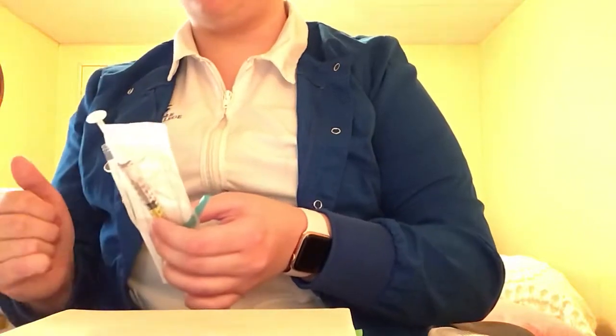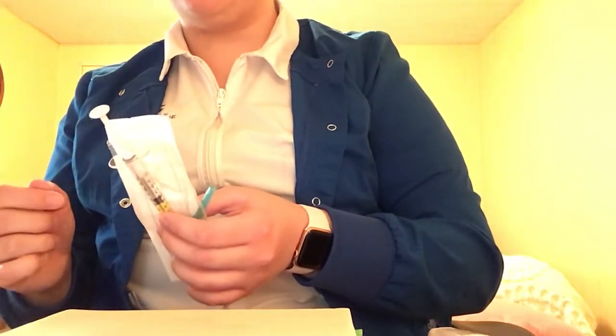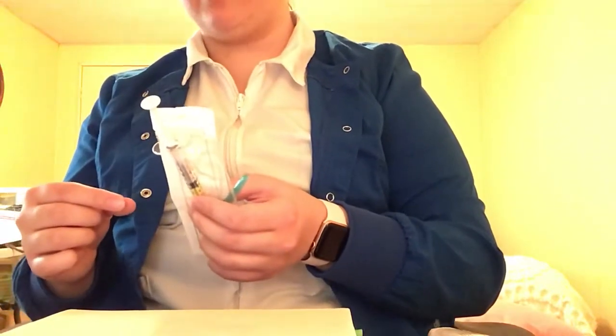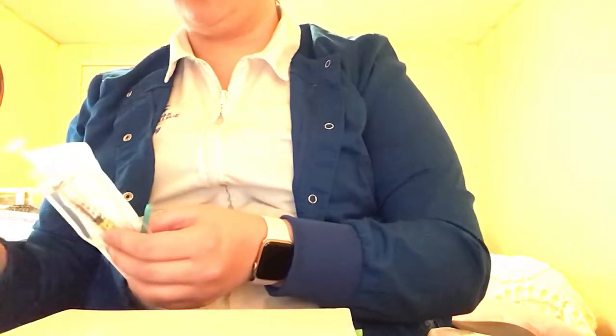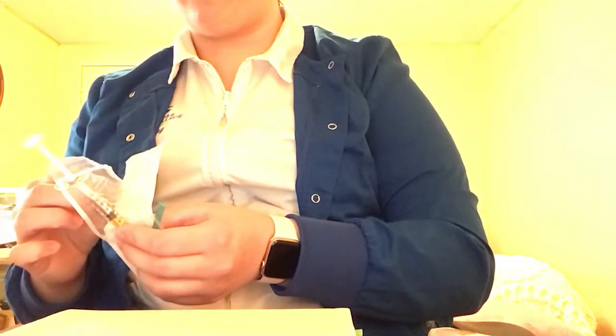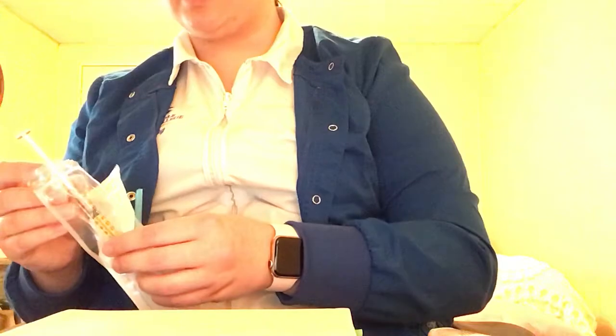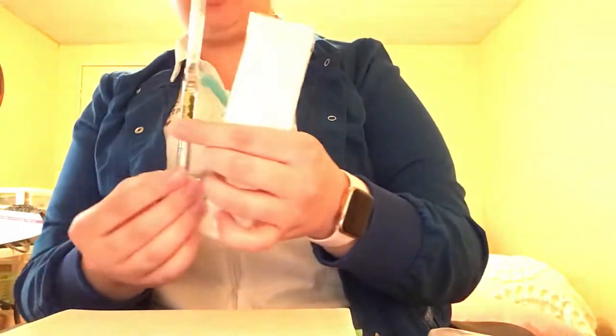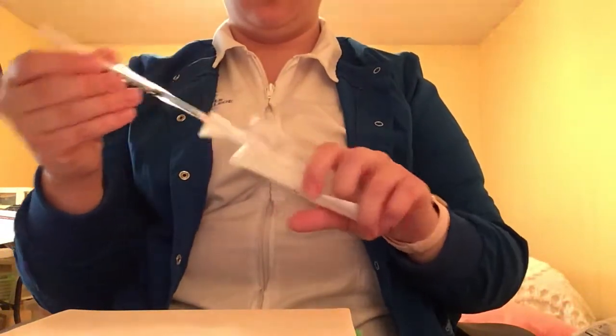So this is for Anna Powolowski, May 5th, 1957, penicillin allergy, and the reaction is hives. This is the influenza vaccine. It is for 0.5 mLs, and it's going to be given at a route of intramuscular, and the time is going to be 16:20. And now I would take both of my syringes and verify that they are the correct dosages. So that one is 0.5 mLs, and this one is also 0.5 mLs.